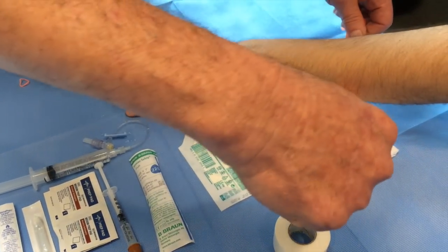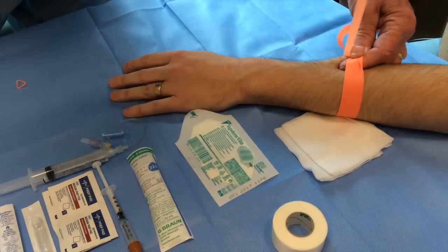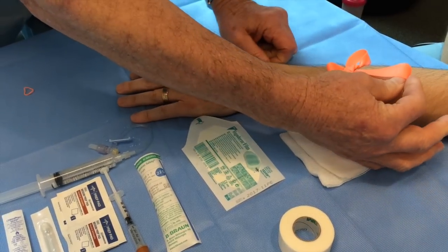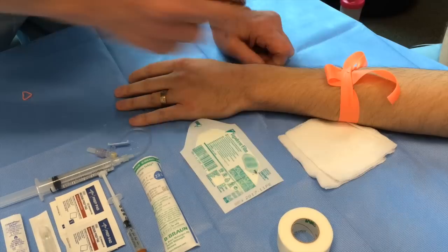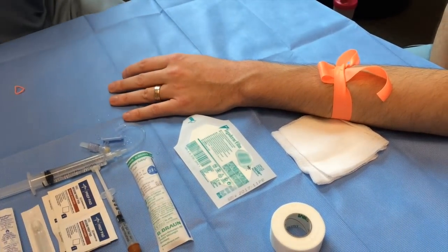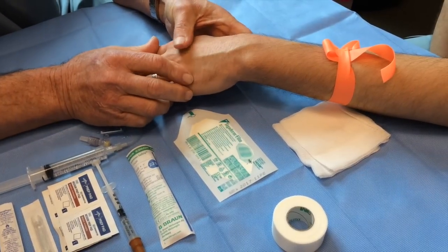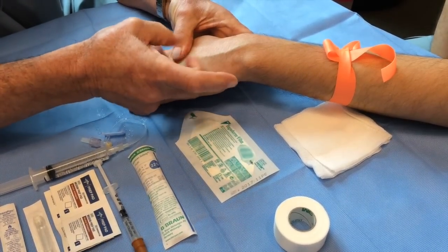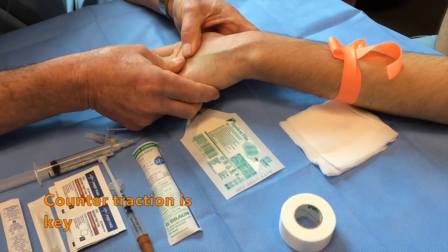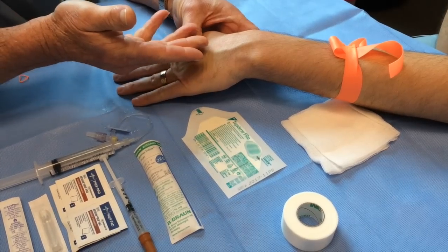Place the tourniquet above the planned site, pull up tightly, and then underneath. This is where you can release the tourniquet. Make sure that you're comfortable when you do this. It's probably better to select a site before you start working. A little digital pressure and counter traction on the skin gives you a real good idea of where you're going to work.